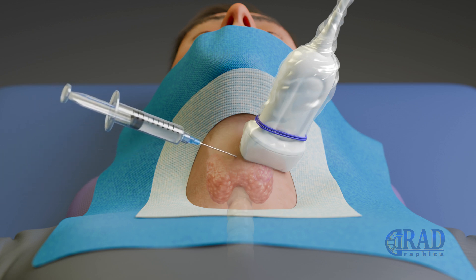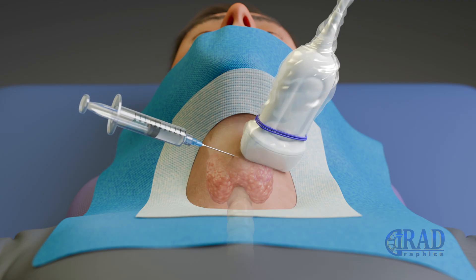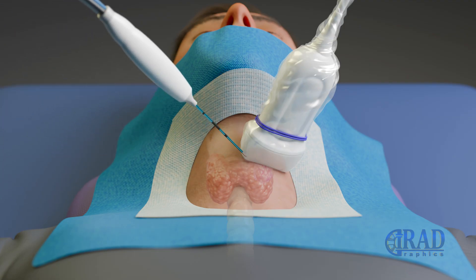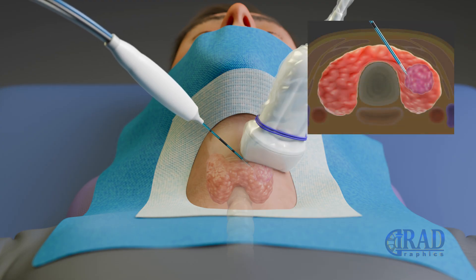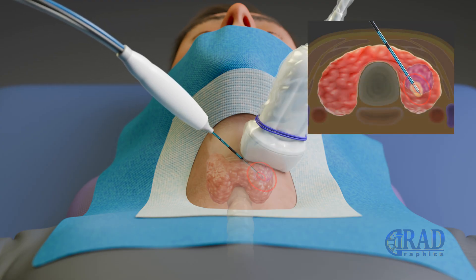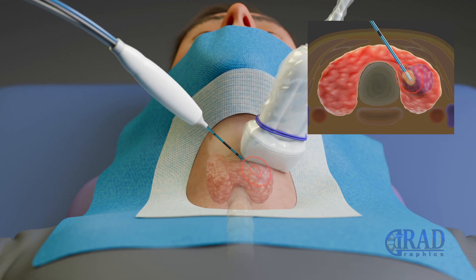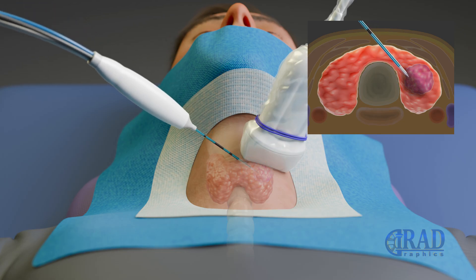A small amount of local anesthetic is administered to numb the skin and deeper tissues. Under continuous ultrasound visualization, a fine ablation probe is advanced into the target nodule. After the tip position is confirmed, controlled energy is delivered to treat the entire nodule. The probe may be repositioned as needed to ensure complete coverage.